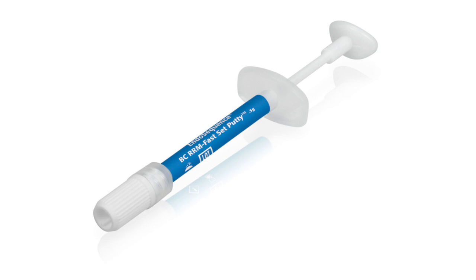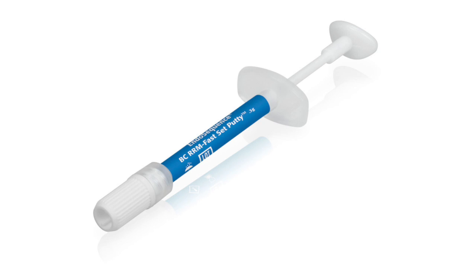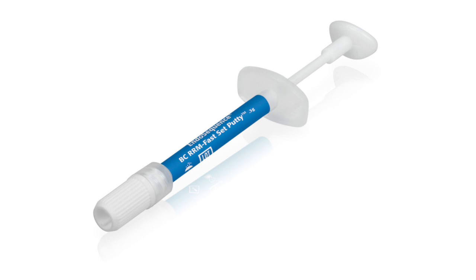Once the perforation site is disinfected, isolated, and dried, seal the area with a biocompatible material like the BC Putty Fast Set. Keep in mind that the goal is a clean disinfected dentinal ring at the site of the repair prior to the repair procedure. This is critical to success.